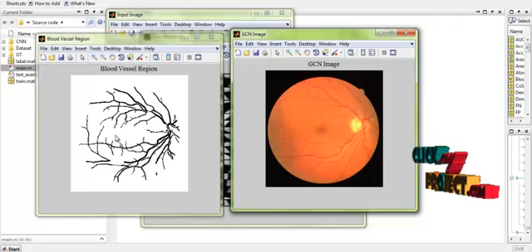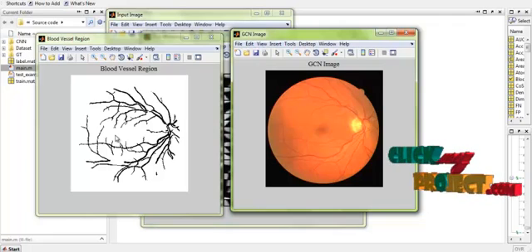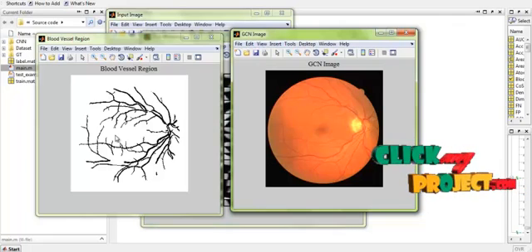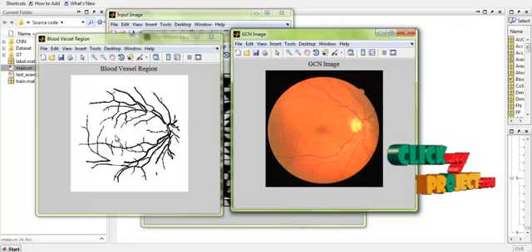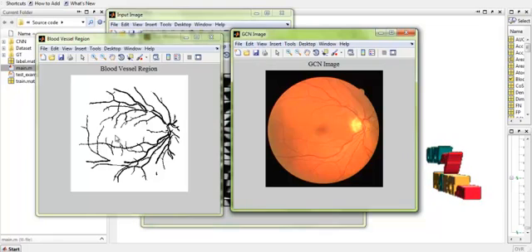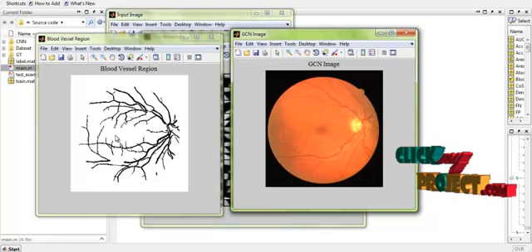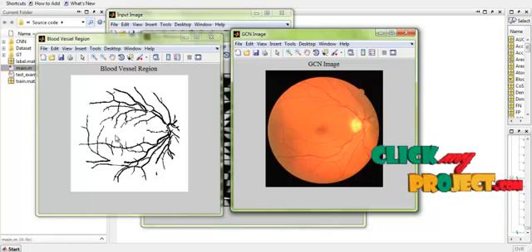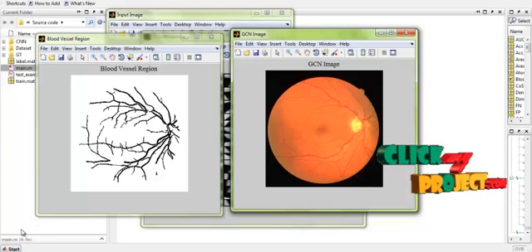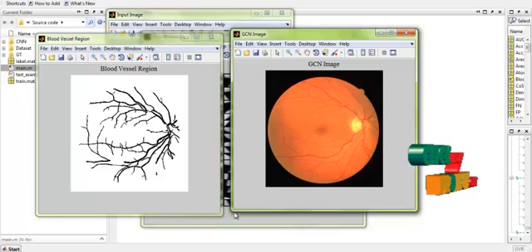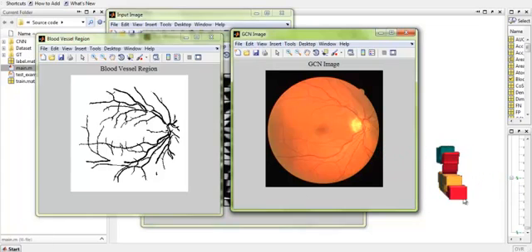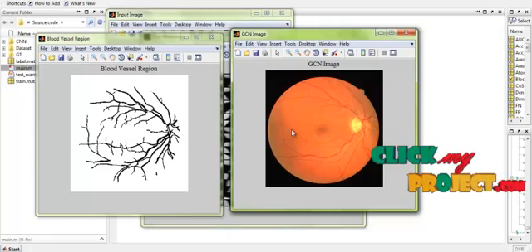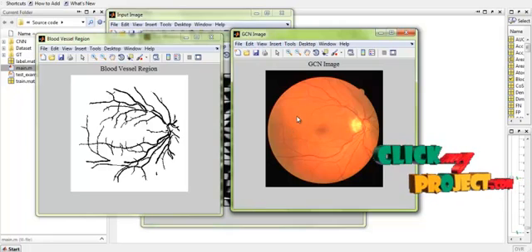Thus we have obtained the blood vessel regions from the input image. After that process, we extract the performance for the proposed approach. The performance of the process is measured in terms of performance metrics.